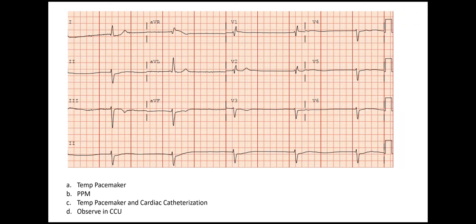So, my problem is that I have to follow up the patient, and there is the safety issue. In the last patient, we did not put any temporary wire or pacemaker. We'll be following up in the office. What about this one, Wadud? Have you discontinued the drug and put in a temporary? The patient came in with bradycardia. This was the admission EKG. Yeah, we stopped everything. And now this is like 10 o'clock. Unfortunately, I was called in for another patient with cardiogenic shock and a missed anterior wall STEMI.